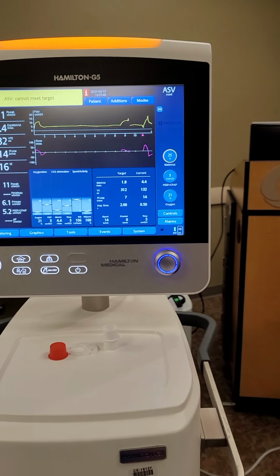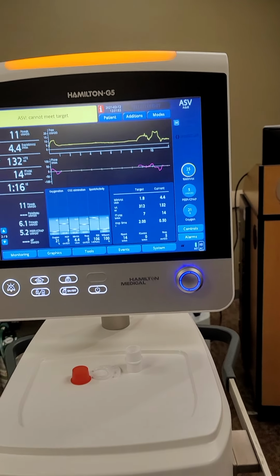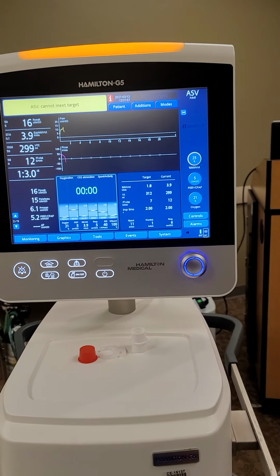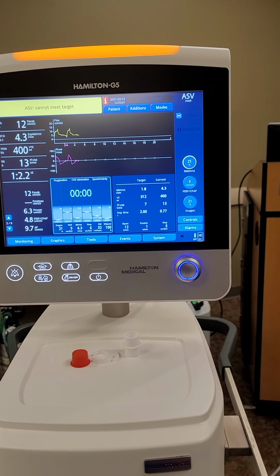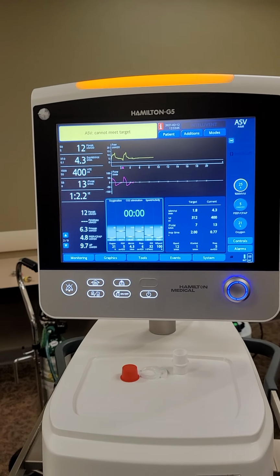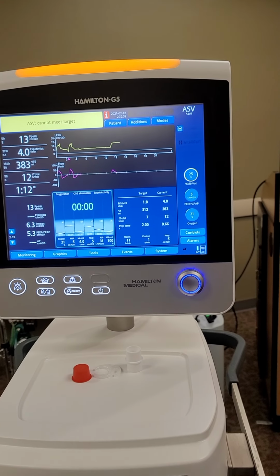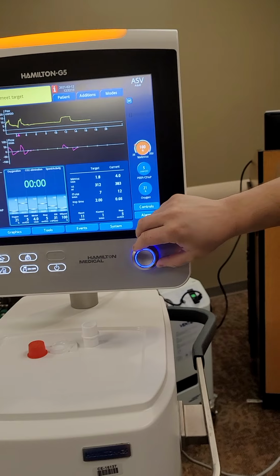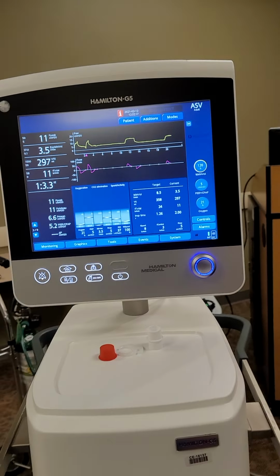Because some of the patients will be asynchronous with the vent, would you recommend we switch them to ASV first before we paralyze them? Let's say they're on 10 or 12 of PEEP, but they still kind of. If they're async, exhaling against the vent, you're getting flow sensor alarms, stuff like that, and the vent is basically saying, hey, your patient and vent aren't jiving, then 100% absolutely you can try ASV to see if it'll help your patient synchrony. Okay, that's good.